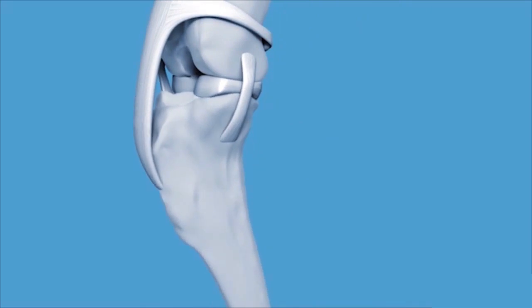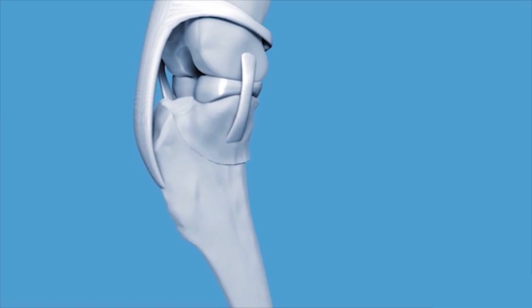In the case of TPLO, a curved cut is made in the top of the bone. That curved cut is very specific, based on a pre-surgical plan. It allows us to take the top portion of the bone and rotate it backwards in order to create a leveled slope relative to the long axis of the bone. This changes the mechanics of weight bearing in such a way that it corrects for the lack of a cranial cruciate ligament.